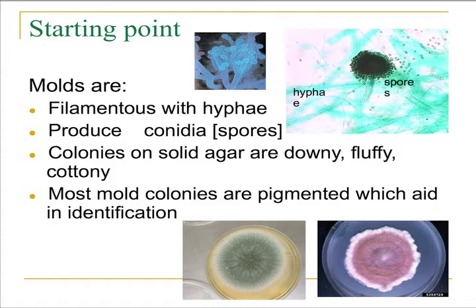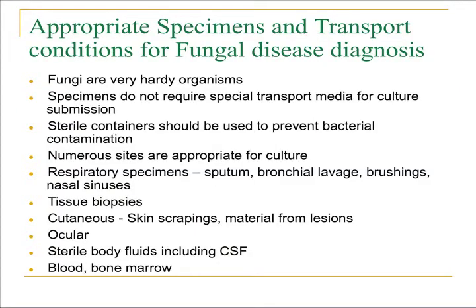On the next slide, we'll talk about appropriate specimens and transport conditions for fungal disease diagnosis. Fungi are very hardy organisms, and they can grow from many of the specimens that are sent to microbiology for culture. They don't require any special transport media. Sterile containers are quite adequate for the transport of specimens.